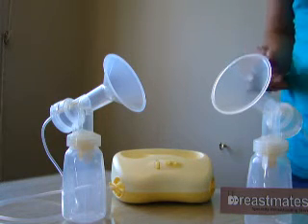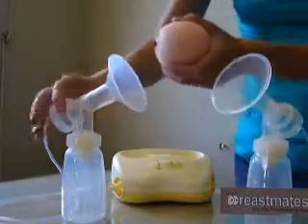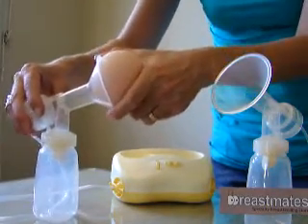Hi, I'm just going to do a demo of the Modella Mini Electric Plus, the double breast pump. I'm just going to show you as a single pump because it's easier while I'm recording.